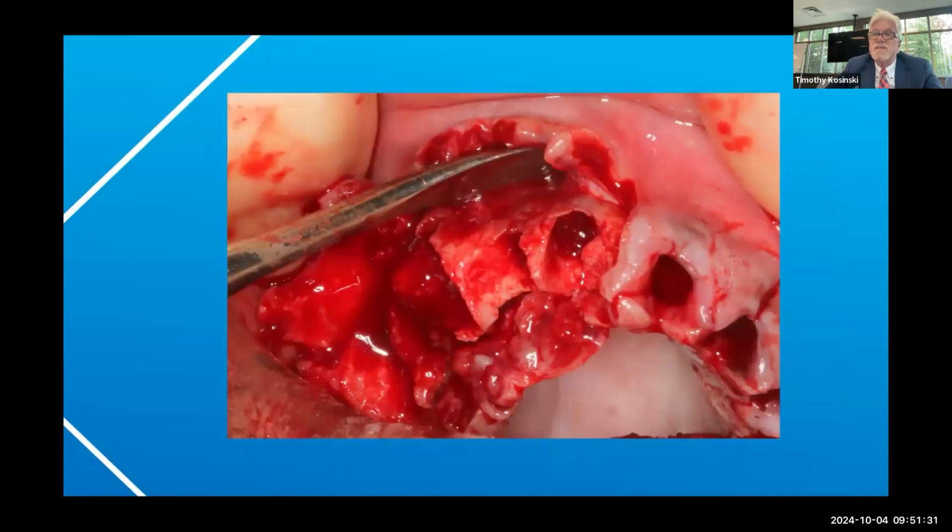We have to remove diseased bone. And very, very importantly, I'm going to slow down for a little bit, Dr. Park. You need help with these with trained diagnosticians and the team at Glidewell, because when we're doing the zirconia or bruxer implant retained prostheses, our full arch screw retained implant retained prostheses, we must have 14 to 16 millimeters of interocclusal space per arch.